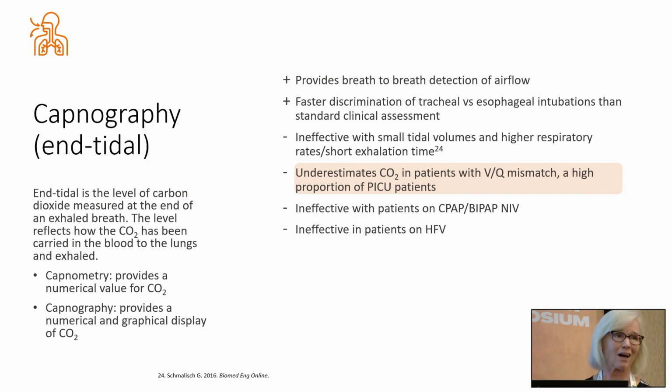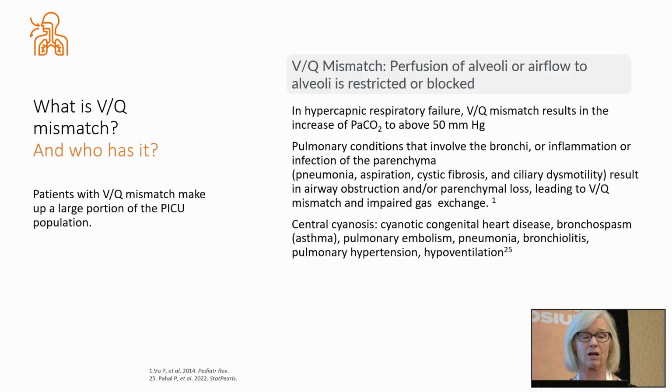It also gets gunked up a lot of times with secretions or humidity. The other big thing about capnography is that it underestimates patients who have a VQ mismatch, which is a high portion of patients with ARDS, whether it's in a PICU or whether it's in adults. And patients with pneumonia, they're all going to have a VQ mismatch. And so the end-tidal CO2 is going to underestimate that.